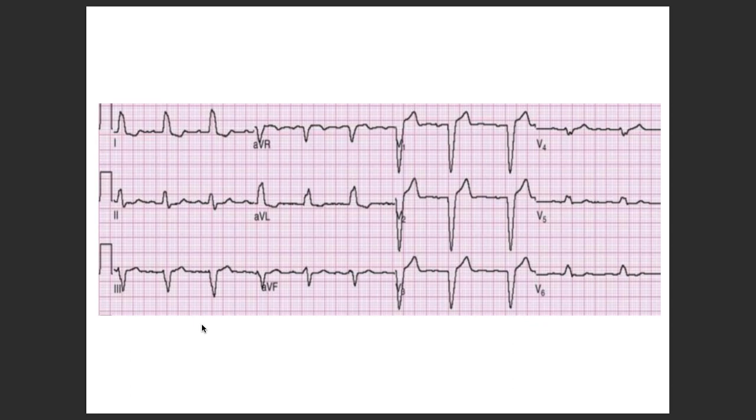So northwest, when do you see that? Like dextrocardia or something. No. Northwest, if you see that axis, your eyes should be alert. Ectopic. Ectopic, yes. VTs. If you see a northwest axis, boom, time for action. Okay? So now you guys will not forget, right? When you say VT? Yeah, northwest is mostly in terms of VT, ventricular tachycardia. So if you come across a northwest axis, be alert. It means they will go into VT or they are having VT.